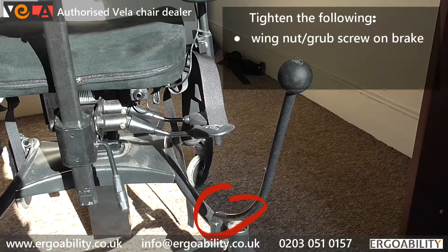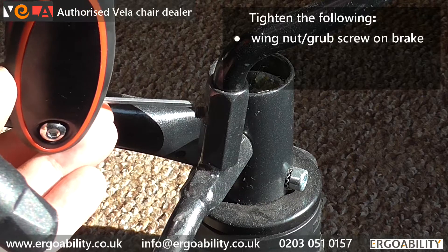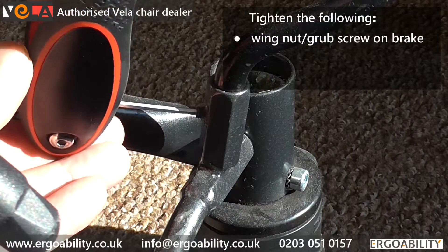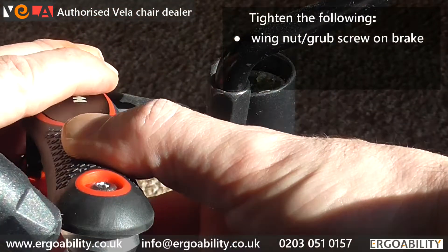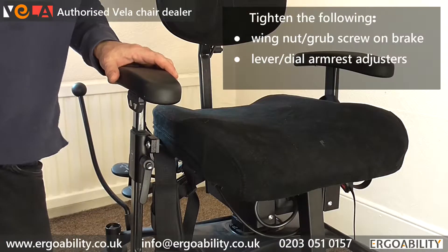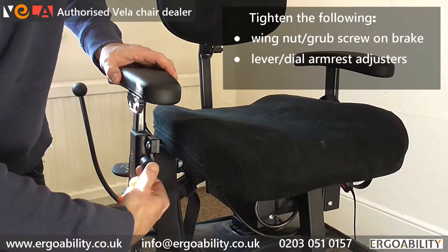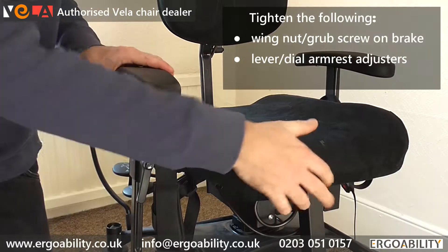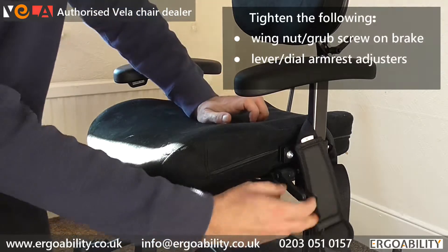The user should regularly tighten all removable parts — the wing nut or grub screws shown here securing the brake lever, and the levers or dials on the armrests. These may look different depending on the chair model. The Tango 100 shown here has a lever, but other models might have knobs or dials that need to be tightened.